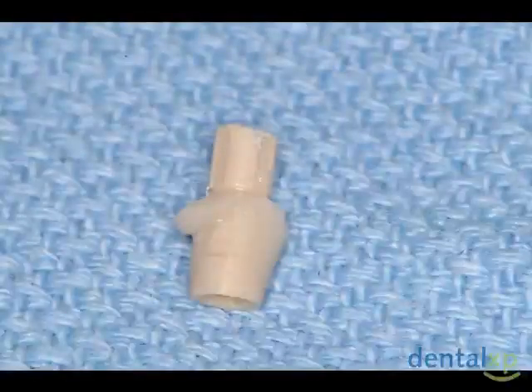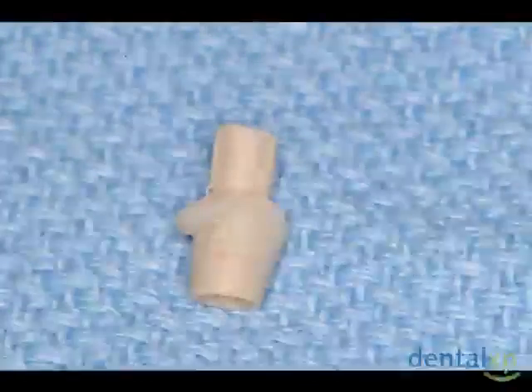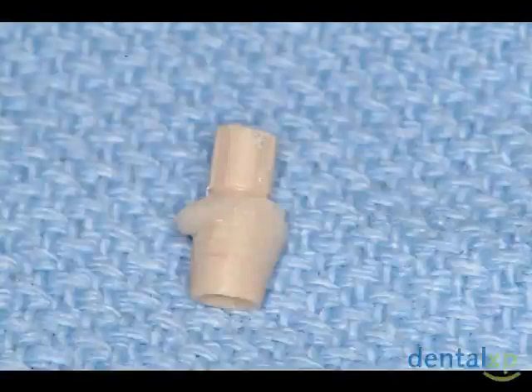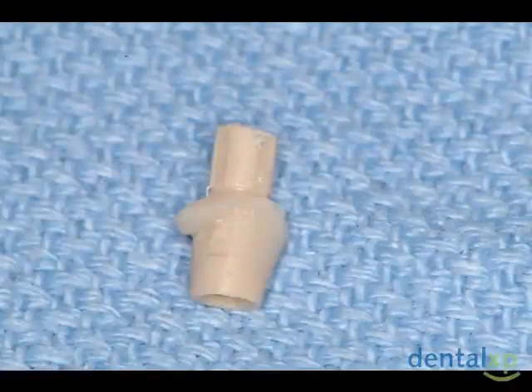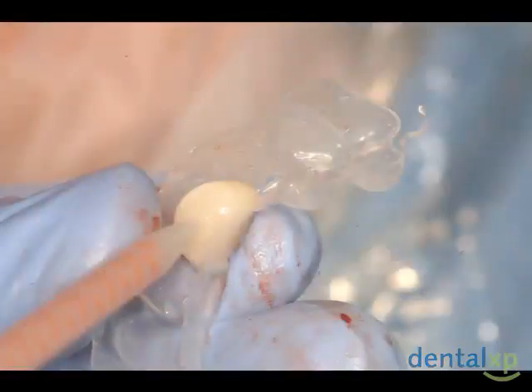To develop a proper emergence profile, a screw-retained provisional crown was fabricated to allow for proper tissue healing. Resin was added to a provisional abutment to develop the proper profile. The provisional abutment with modified resin was placed in the mouth. A stent was fabricated from a maxillary study model taken prior to extraction.